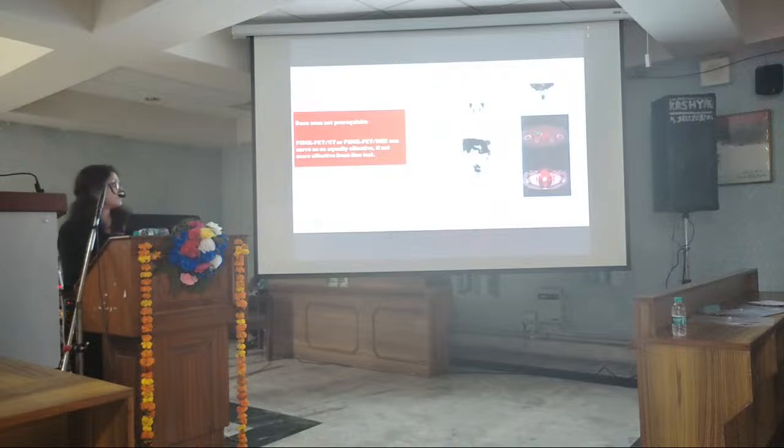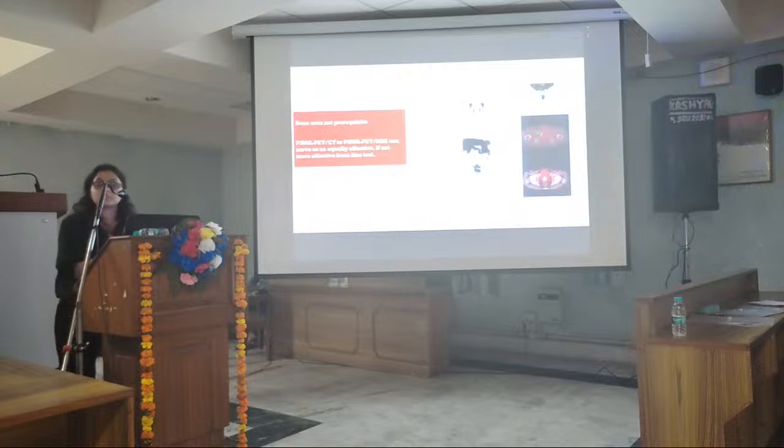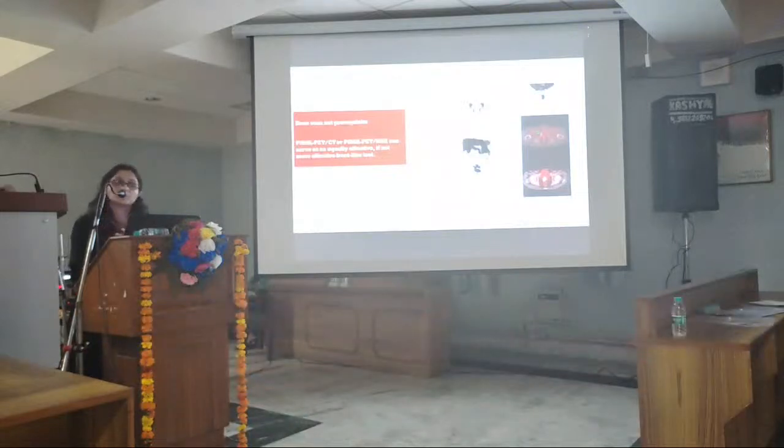One more thing, if we are doing a PSMA PET scan and avoiding a bone scan and a CT scan, we are giving much less radiation to the patient. Exactly, sir. That is again important. In this case, the grade is 3, but PSA is 63.5, so our risk is high, and in this patient there was oligometastasis, multiple bone metastases were shown, because sensitivity is very high, and as the proPSMA trial also showed, it changes management also.